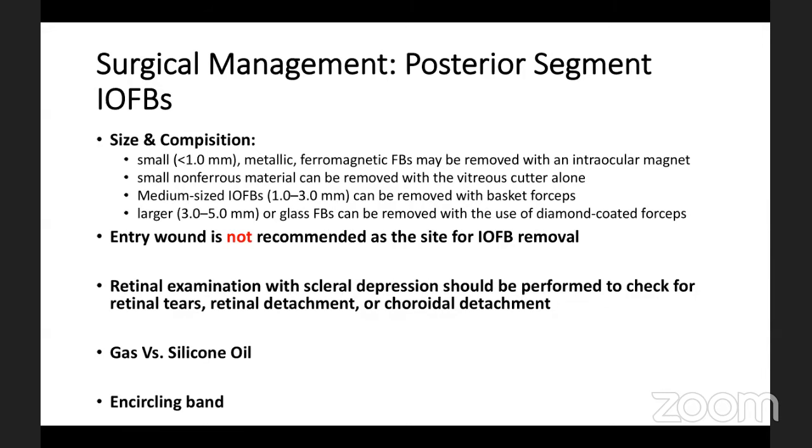In large metallic foreign bodies that are difficult to remove with the intraocular magnet, you'll probably need the giant external electromagnet. The entry wound usually is not recommended as the site for intraocular foreign body removal, as we have seen in the case in Dr. Elbarky's video.